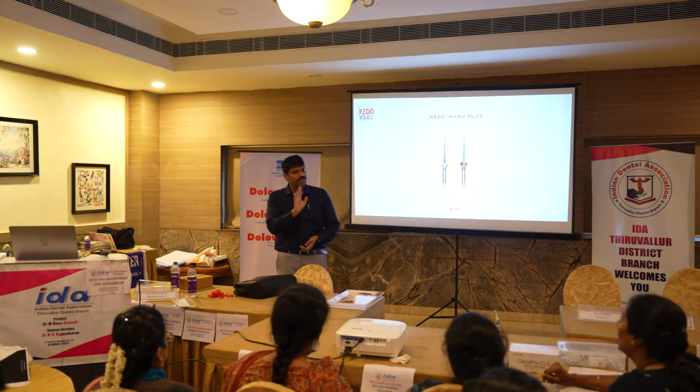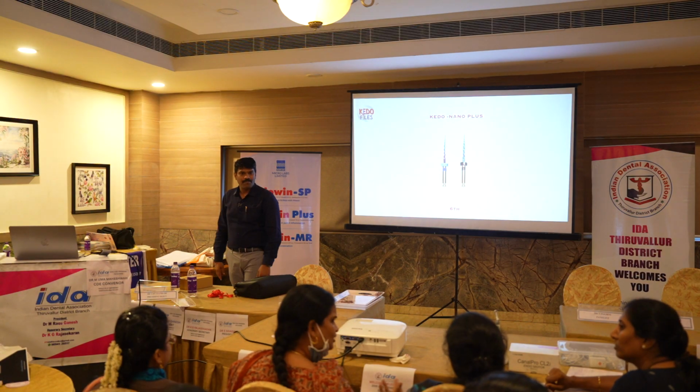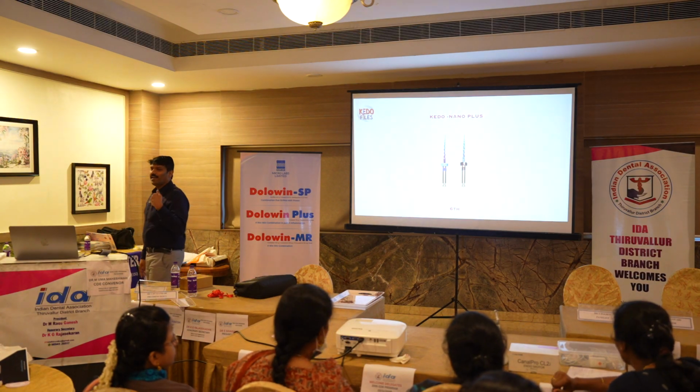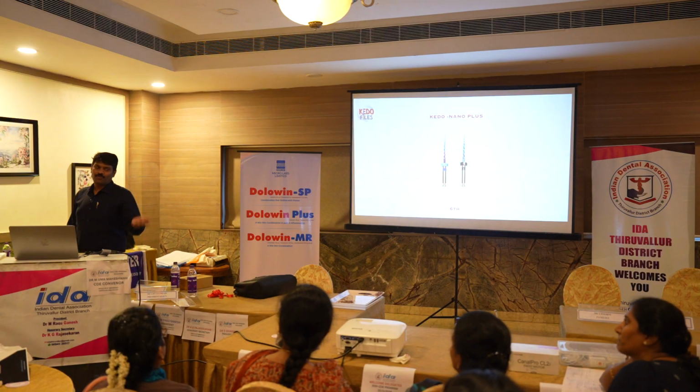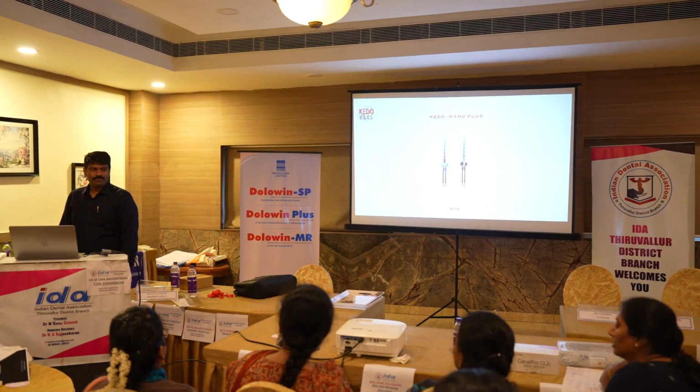See the Root ZX, how it responds. Even with hypochlorite, it will respond in some time. See, even in your primary teeth, after you put a file and take working length, where there is pulpal tissue down, it will give the reading if you use a good apex locator.